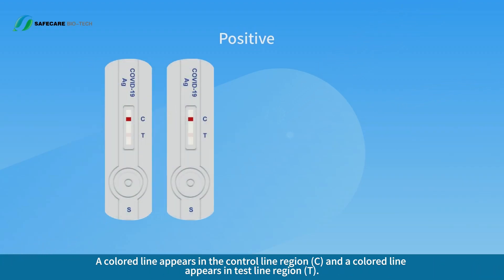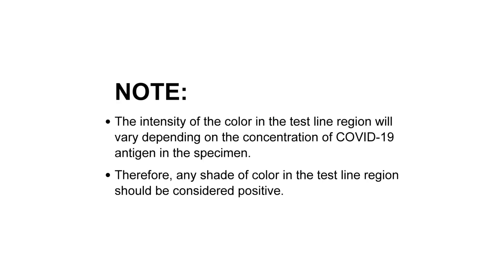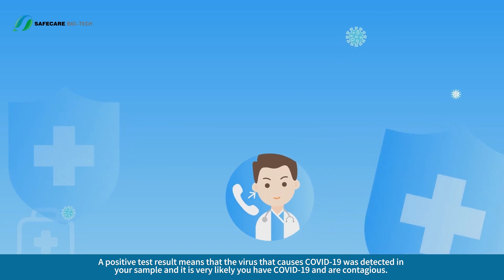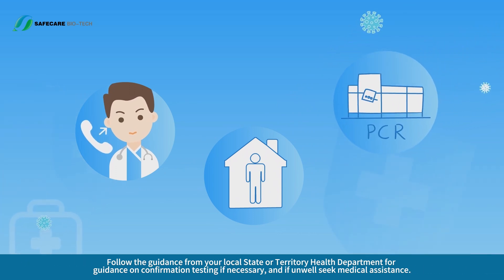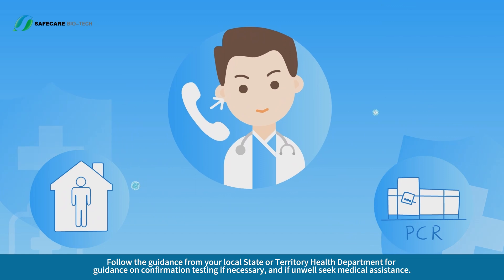Positive result: a colored line appears in the control line region C and a colored line appears in the test line region T. The intensity of the color in the test line region will vary depending on the concentration of COVID-19 antigen in the specimen. Therefore, any shade of color in the test line region should be considered positive. A positive test result means that the virus that causes COVID-19 was detected in your sample and it is very likely you have COVID-19 and are contagious. Follow the guidance from your local state or territory health department for confirmation testing if necessary, and if unwell, seek medical assistance.